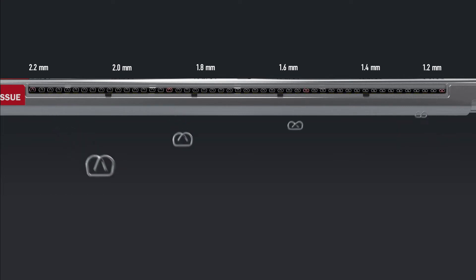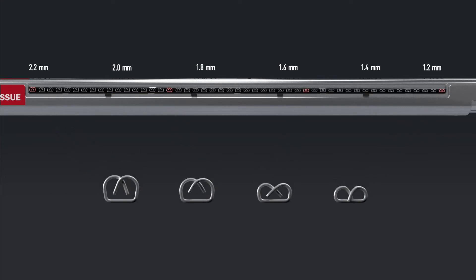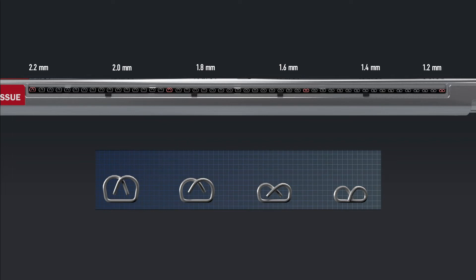Titan SGS provides innovative longitudinal graduated staple technology. Each successive staple is taller, matching the entire length of the staple line more closely with the actual thickness of the patient's native anatomy.